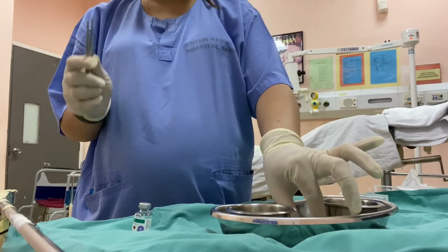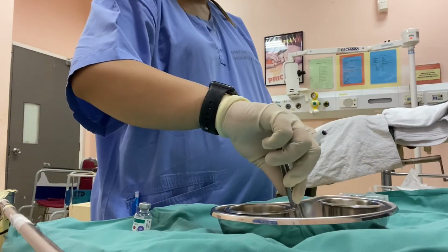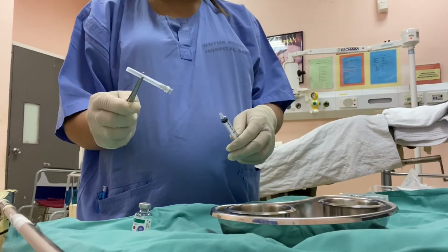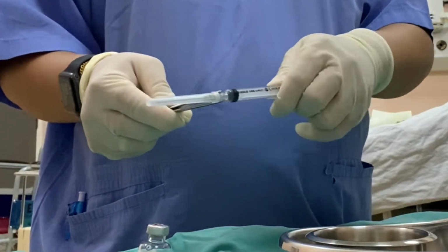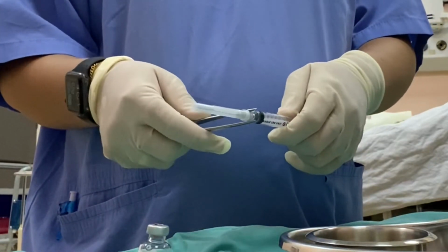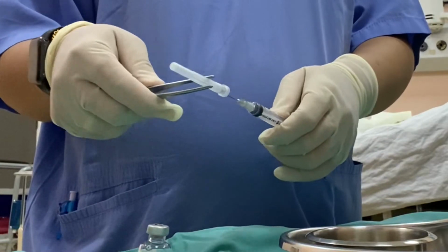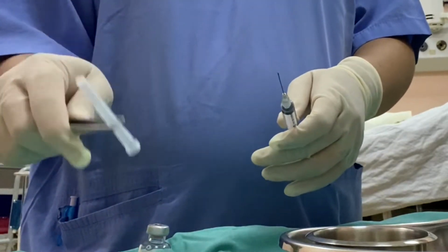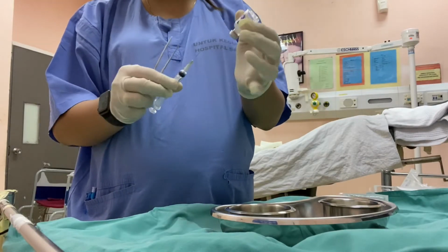Firstly, we use this forceps. We will take this bigger needle and place it securely on the syringe. Open the cap of the needle, and then this is the medication.